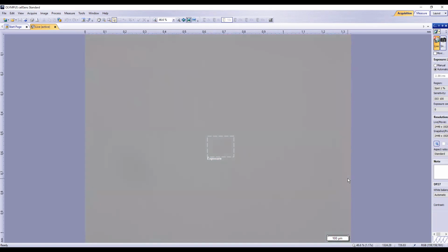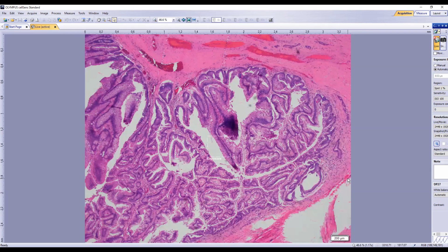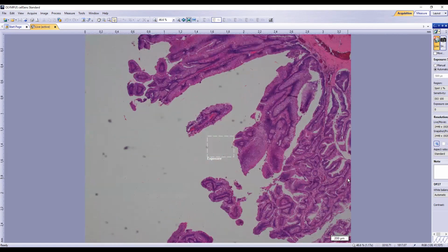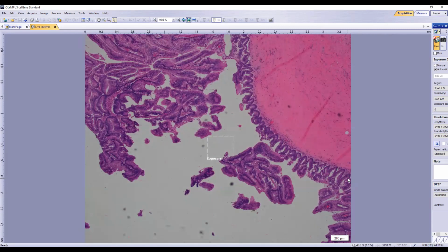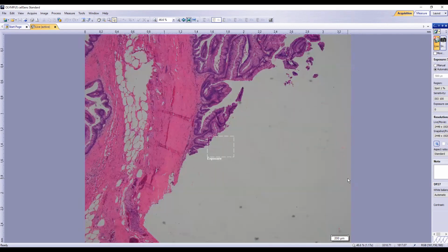Okay. Now this is another cyst. This time it is a 5 centimeter cyst in the body of the pancreas. Imaging revealed an unremarkable main pancreatic duct but a dilated branch duct. And this is what we have on low power. Looks like tubulopapillaries of some kind.